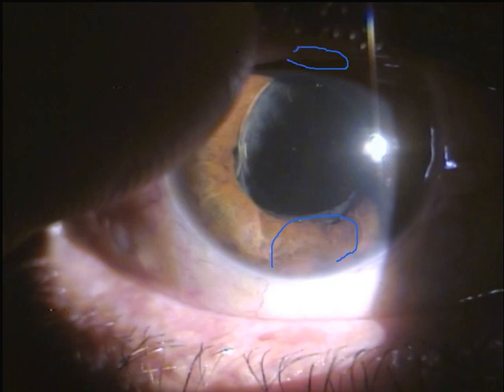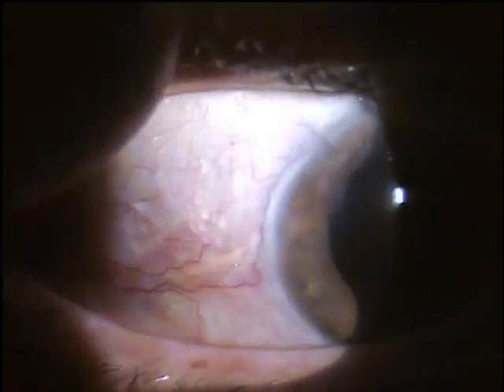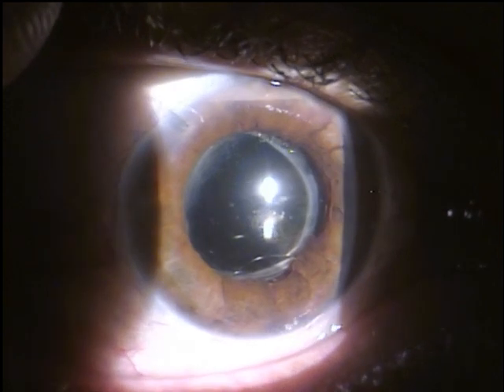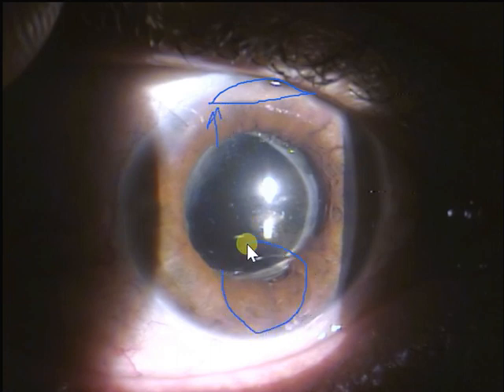So the patient was referred to me today for the evaluation for glaucoma, and seeing this, he's got posterior synechiae formation along with the formation of iris bombé, which I'm going to demonstrate as well. Here you can see this is the superior hyperoleon, or emulsified silicone oil, which rises up, while a perfluorocarbon liquid, heavy liquid, is going to be floating down over here. In order to remove that superior silicone oil, you need to go and remove it from the anterior chamber, probably during surgery. It will come just beneath the endothelium.